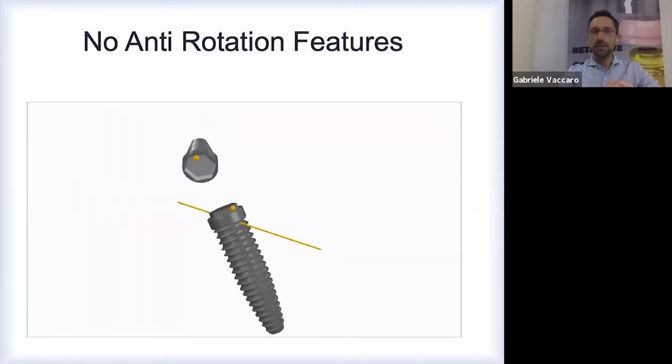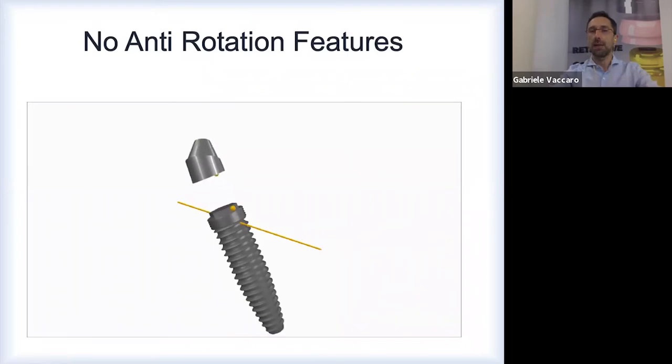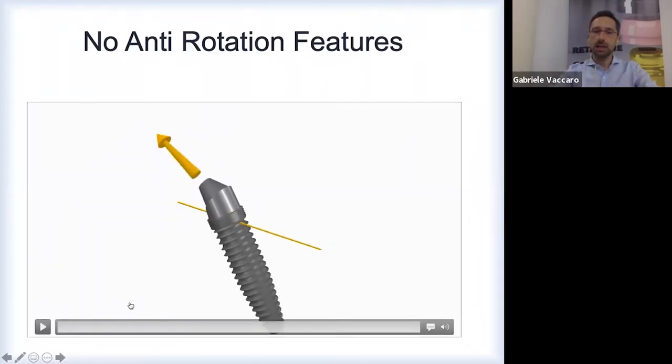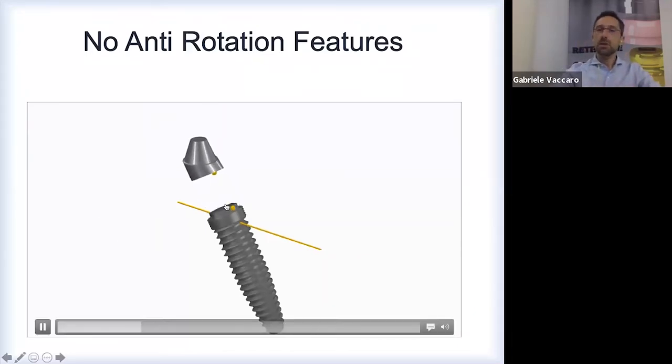So if the surgeon puts this hexagon in the wrong place, the exit hole for the screw can end up exactly where we don't want it, like in the vestibular, the facial part of the crown, or exactly in the middle of the cusp. Since the Equator doesn't have any anti-rotational device, because it's round, it's a complete sphere, as you can see here behind me, we don't have any issue with this.